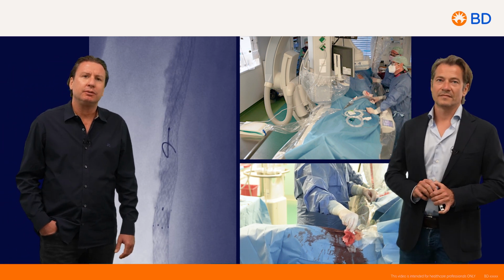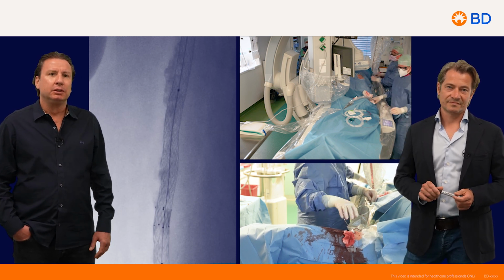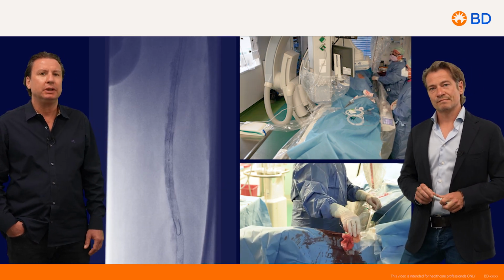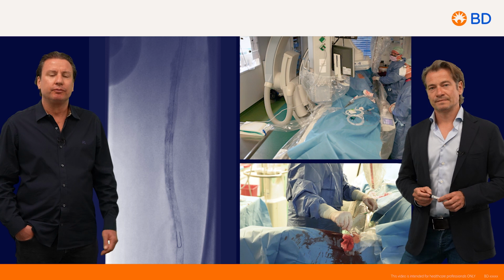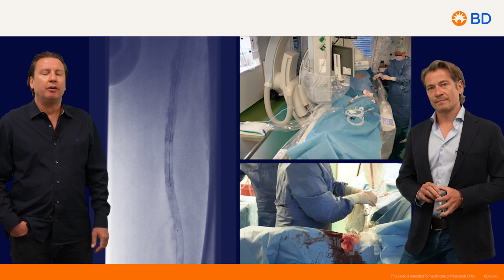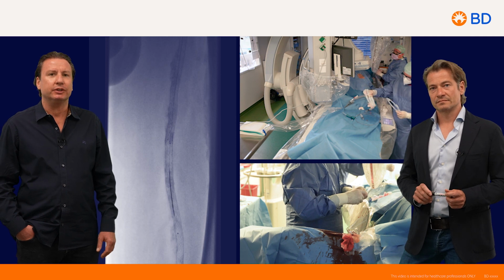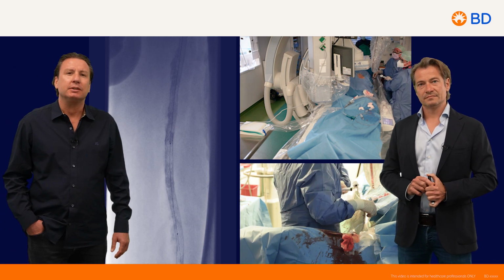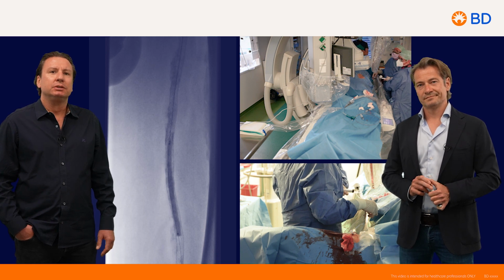But you see, the Rotarex wire is also very useful because it's very stable. It's made of nitinol. The core is nitinol, so it cannot kink. It's very durable. The tip is a bit floppy, which is good because it's atraumatic. If you use it during the maneuvering of the device, it cannot harm because it's a really floppy tip. However, sometimes to cross really organized occlusions, it's better to use another wire, just your CTO wire, and then exchange to the Rotarex guide wire, like in this case. So also here we did a little bit of pre-dilatation.